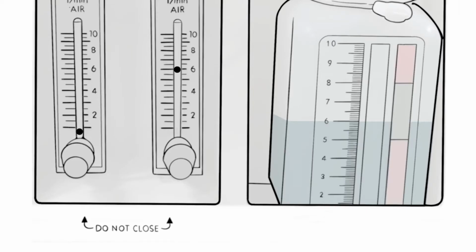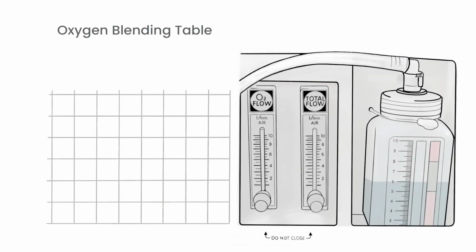Remember, the way we set the correct amount on the CPAP oxygen flow meter is actually to adjust the output of the concentrator or other source. The regulator on the CPAP is kept open. So let's see how this works.